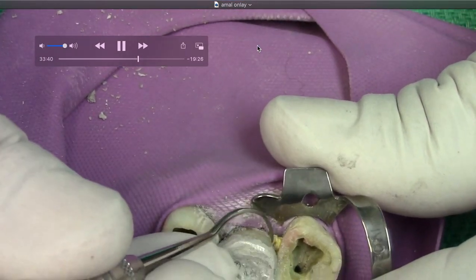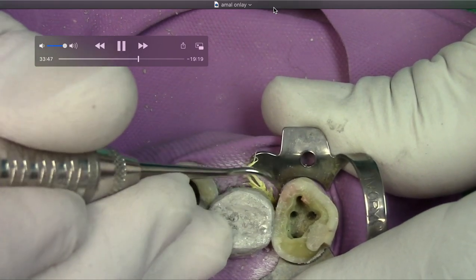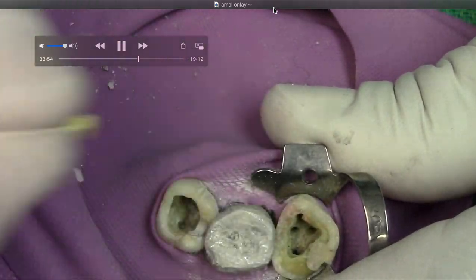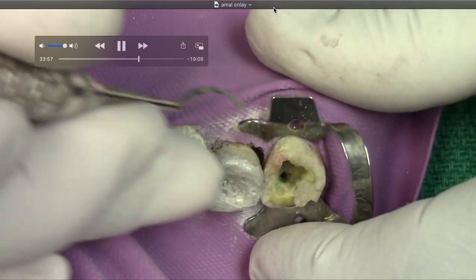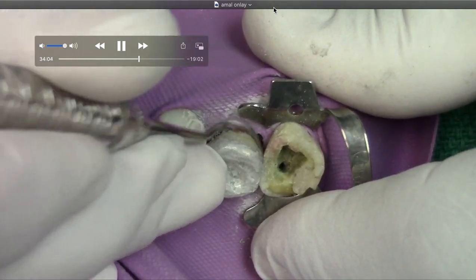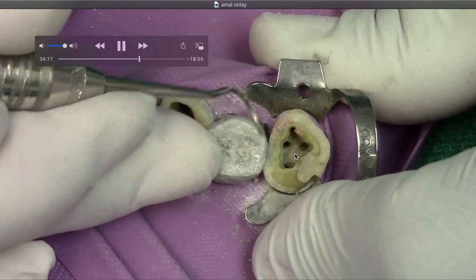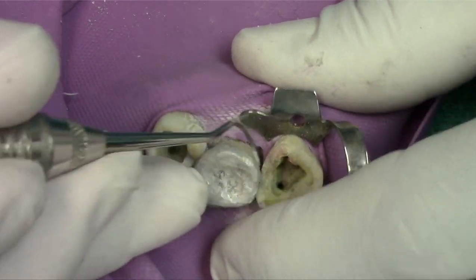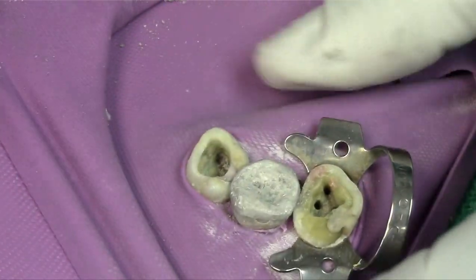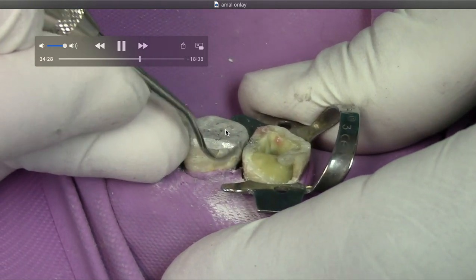Now we've got our band off. We're going to flick out that Teflon — hopefully the tooth doesn't come out. What we're going to do is review our gingival embrasures. You can see it's nice and smooth — nothing overhanging.